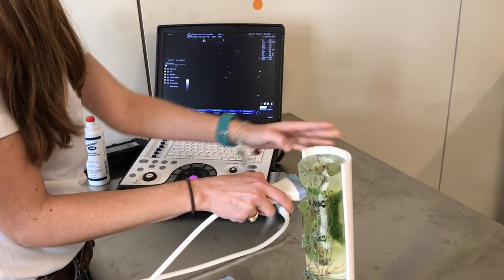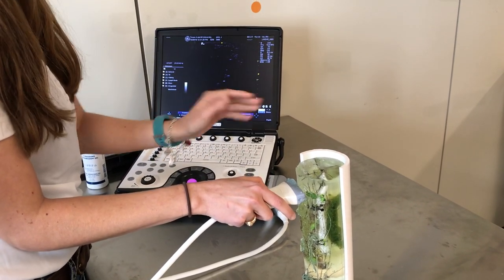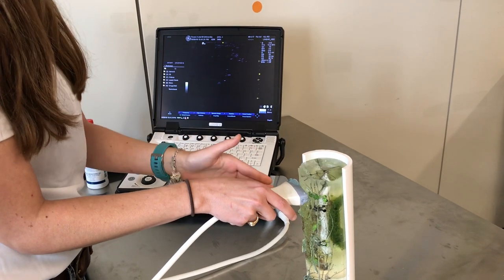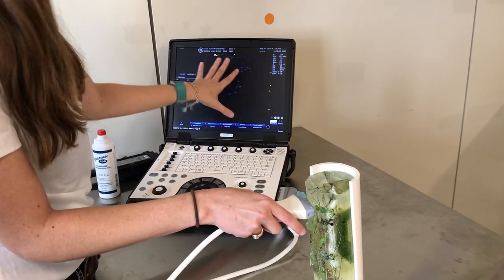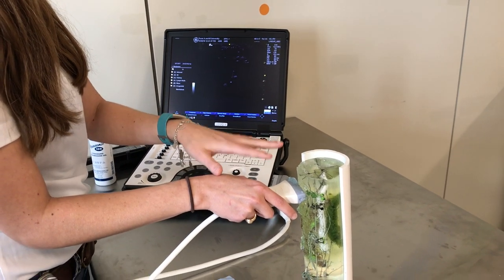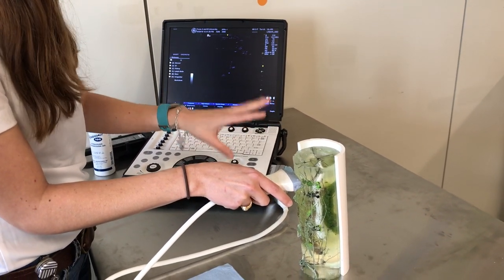So if this is a left leg, my notch is lateral. If this were a right limb, my notch would be medial. Since my image matches what I see, I understand what's going on a little better.